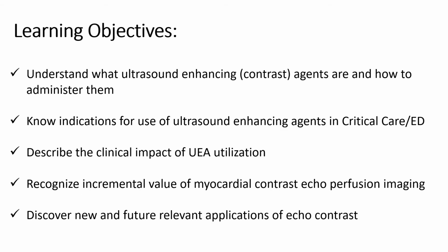The learning objectives that I'd like to cover with you over the next very quick 20 minutes is to understand what ultrasound enhancing or contrast agents are and how to administer them, to know indications for the use of ultrasound enhancing agents in the critical care and emergency department environments, to describe the clinical impact of their use, to recognize the incremental value of myocardial contrast echo perfusion imaging, and to become aware of new and future relevant applications of echo contrast.